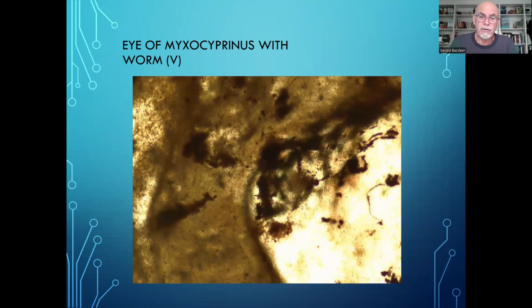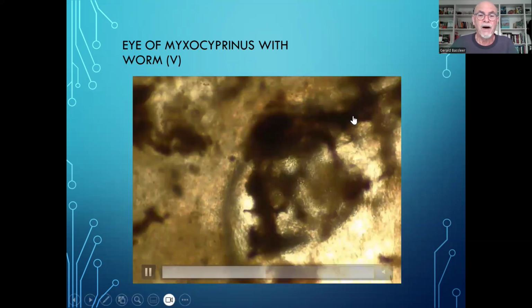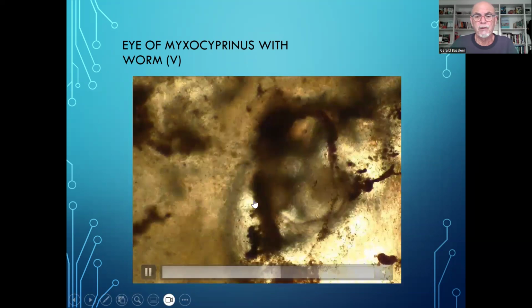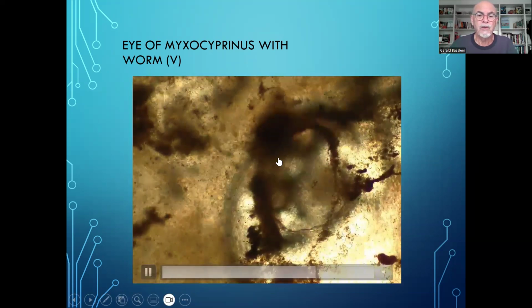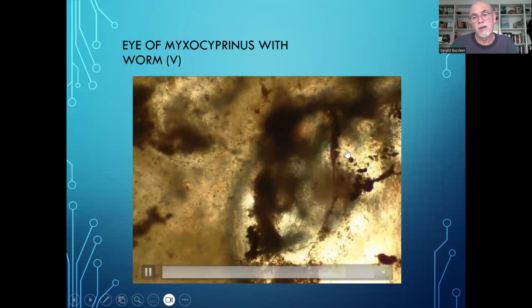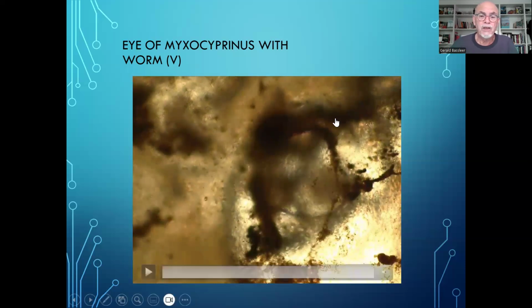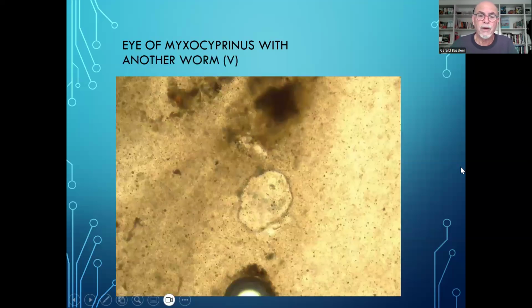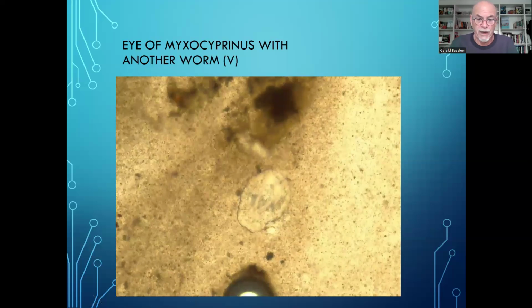That is a worm. Well, we found a worm on this particular part of the eye. It was covered between the necrotic tissue. You can hardly see the worm. Here he is below, of course. That's how you take a sample. It's not always perfect, but you could see that there is a little animal. It's a worm.